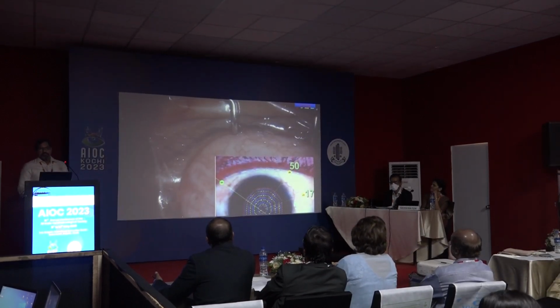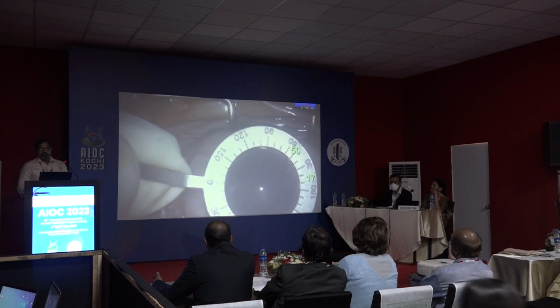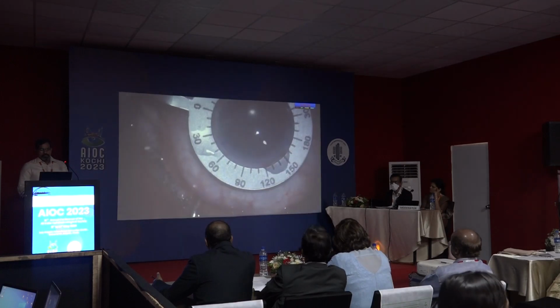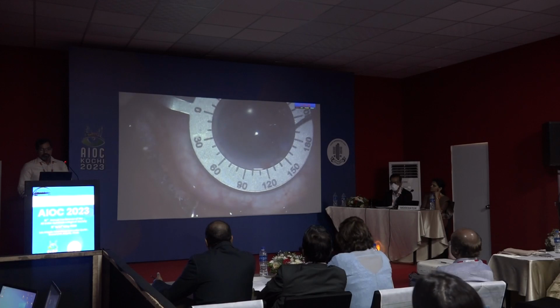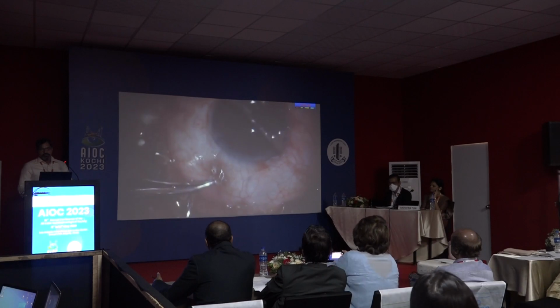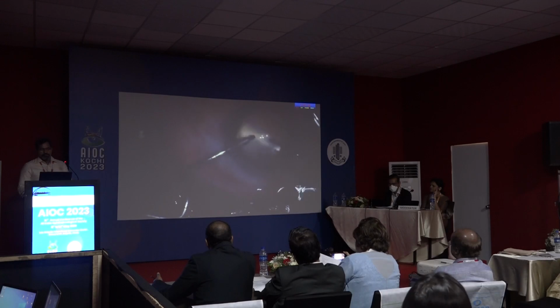Here I am making two landmark points at 17 and 50 degrees on the patient's eye. Hold the degree gauge and align it with the markings. Now mark the site of incision, which is at 136 degrees. After lens implantation and viscoelastic removal, bring the degree gauge again to mark axis of alignment on the limbus at 145 degrees using 17 and 50 degree landmark points as reference. You can also mark the axis of alignment on the cornea. Finally, align the toric lens axis with the corneal markings.